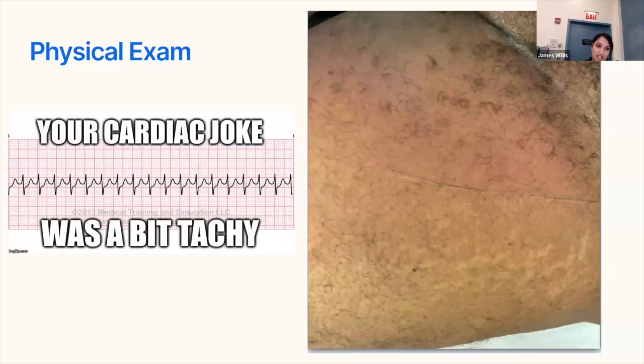So he was tachycardic and he had a large area of redness and fluctuance in the left inguinal upper thigh region with no crepitus, but it was erythematous and it was very tender to palpation and it was very subtle on exam. This was a reminder of how it's really important to do a full head to toe exam because we didn't really know what was going on exactly.